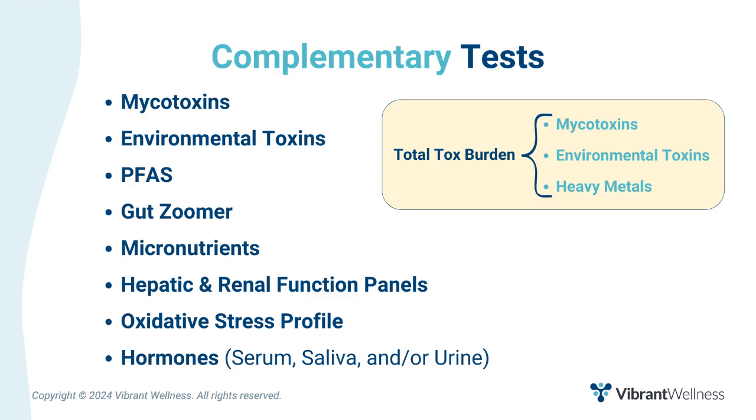The oxidative stress profile to assess if free radicals formed by heavy metal exposure are using up your client's antioxidants and contributing to accelerated aging, and also hormones, be it serum, saliva, and/or urine, to investigate heavy metal toxicity impact on hormones and reproductive symptoms.